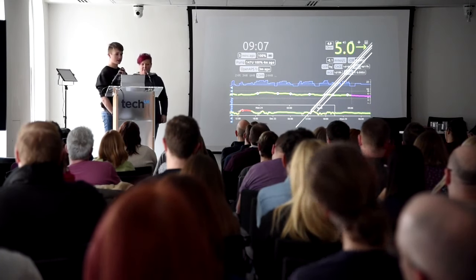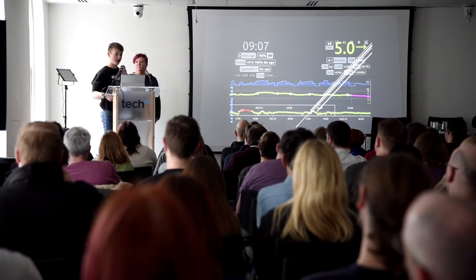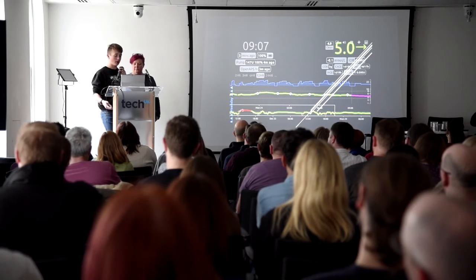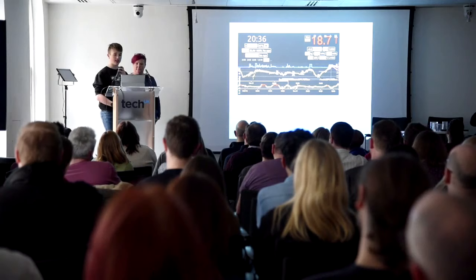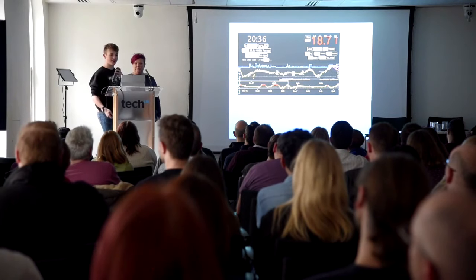Another great thing is, due to my sport and the lows, before when I wasn't looping, I'd spend several hours in hypo, have tons of carbs, but now I'm having maybe one hypo, and I'm having 3 to 6 grams of carbs to come out of low twos, but it doesn't always work.